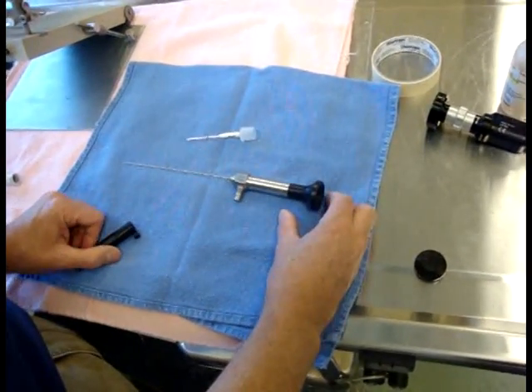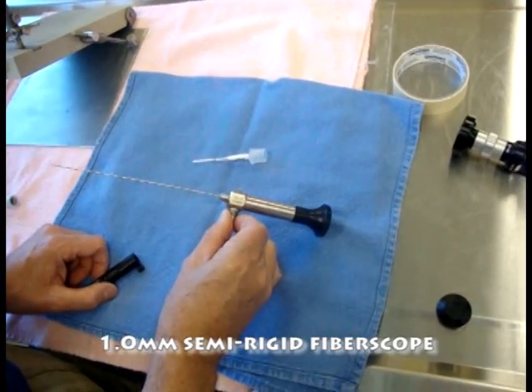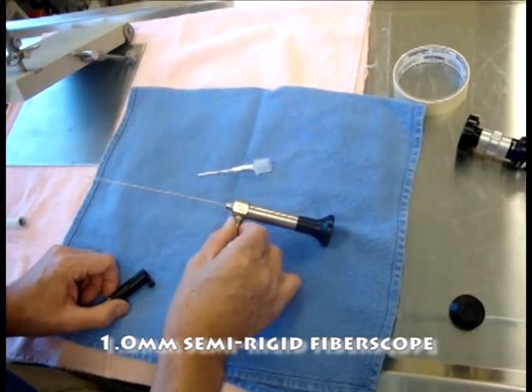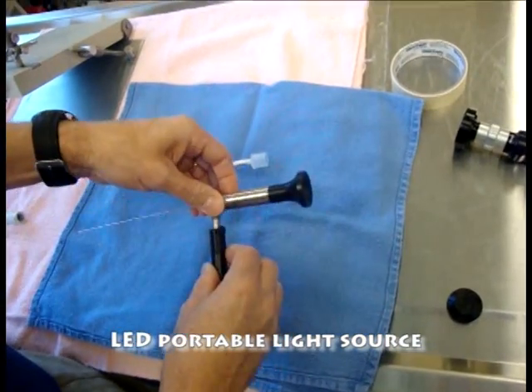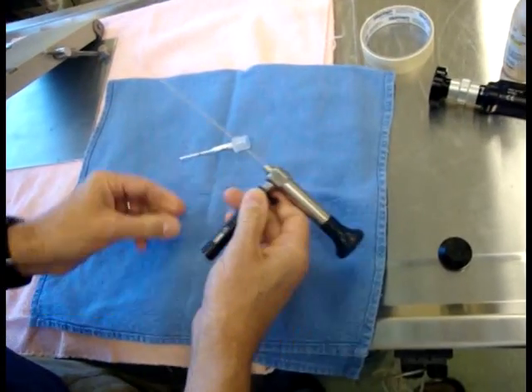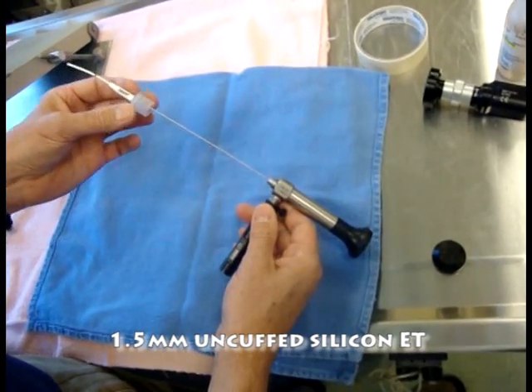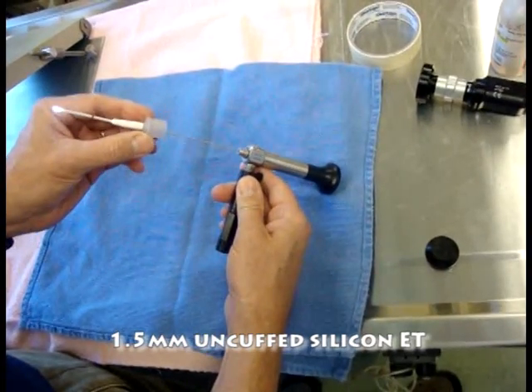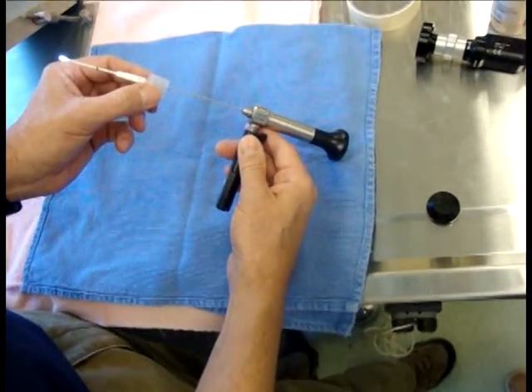Today I'm going to intubate a rat for a mammary tumor removal. I'm going to use MDS's 1.0 millimeter semi-rigid fiber optic endoscope to perform the intubation, along with MDS's small LED light source that attaches to the scope. We're going to use a small modified Jorvet endotracheal tube — it's 1.5 millimeters, so it fits over the end of the endoscope and is the right diameter for my rat patient.